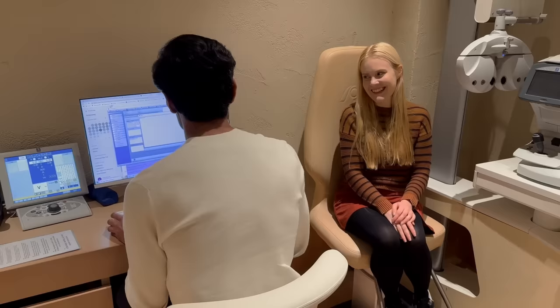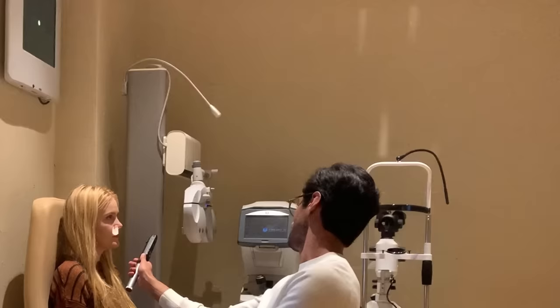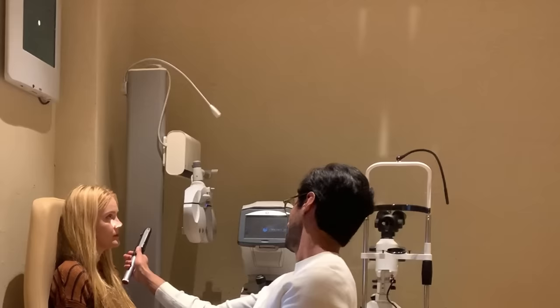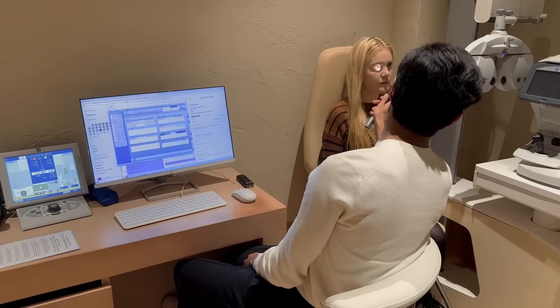Cool. So there's a few tests I want to do first. I'm just going to put something on the screen now. You see the spotlight up there? Yeah. Okay, so I'm just going to check how well your pupils react to light. So if you keep looking at the spotlight for me on the screen. Good. Perfect.